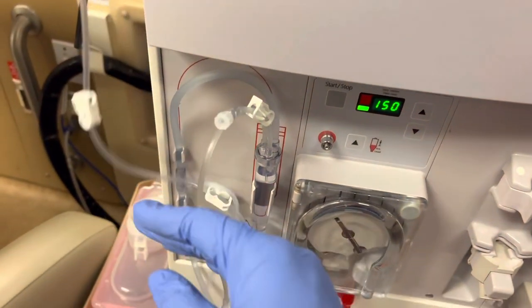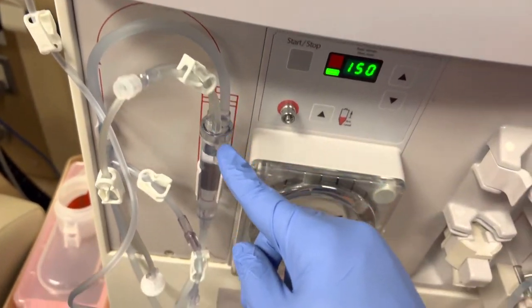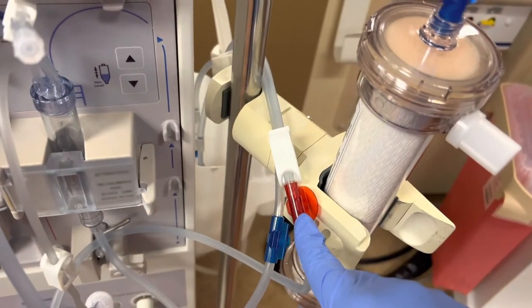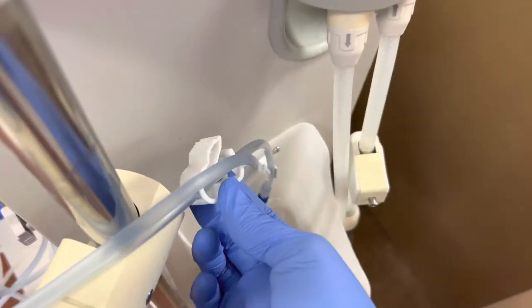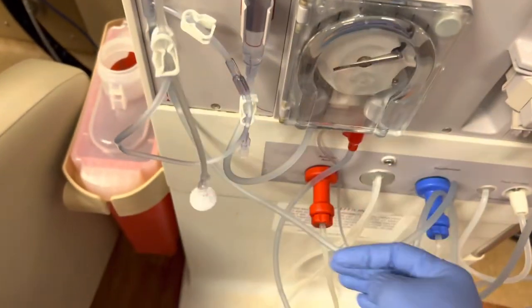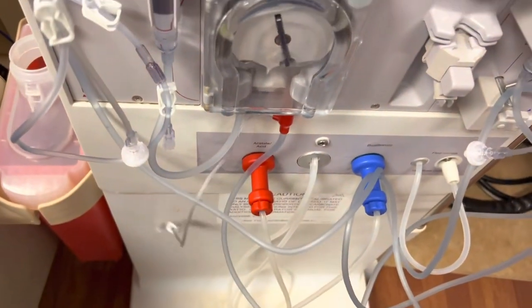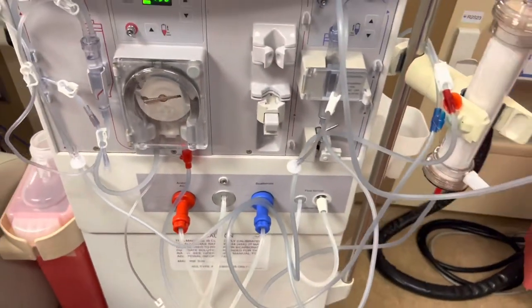Saline line is open, remember. Open saline line. Closed tail. I clamped the arterial. My venous line, the big clamp, is unclamped. That's the tail. The transducer is clamped. My arterial transducer is clamped. The heparin line is clamped. The saline tail, I call it, is clamped. And now I take a step back just to look and make sure it's priming properly.